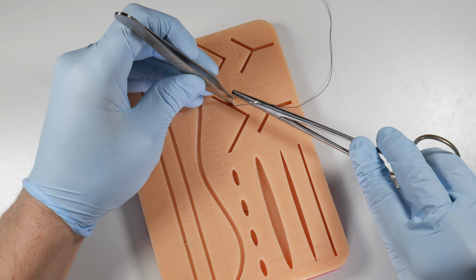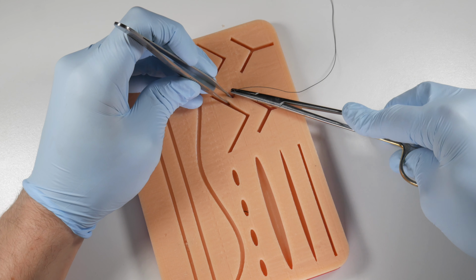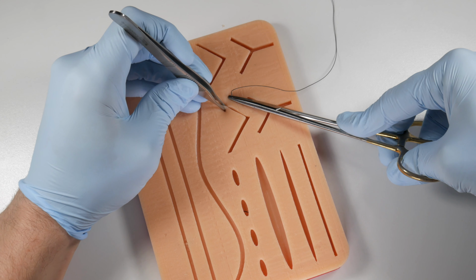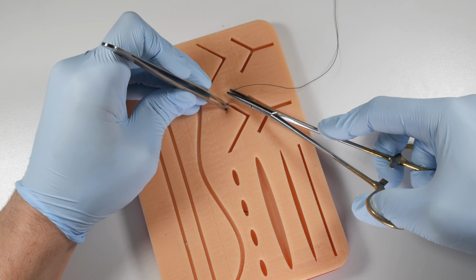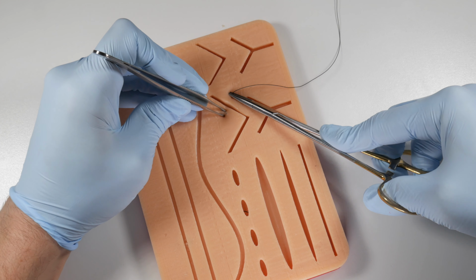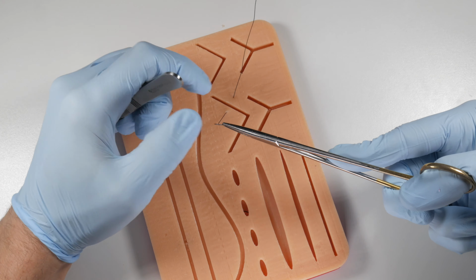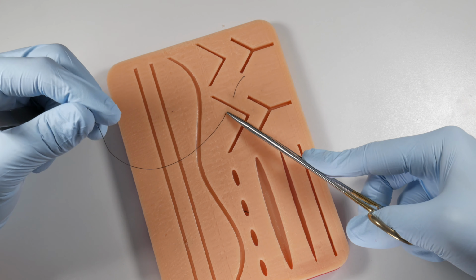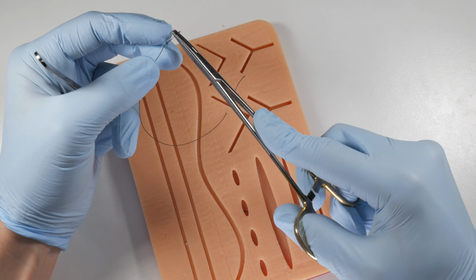So we'll start here by picking up the tissue. We enter in perpendicular to the tissue, out a little farther than we normally would. We're going to rotate this suture through here, and we're going to come out on the other side, a little bit farther out here. There we are. So we've got our suture appearing here, and we're going to grab that tip and drag that through there. We've now got basically two wide bites here. Okay, so that's our first pass through the tissue.